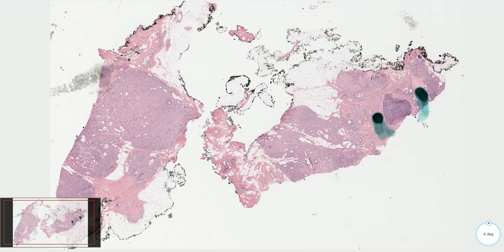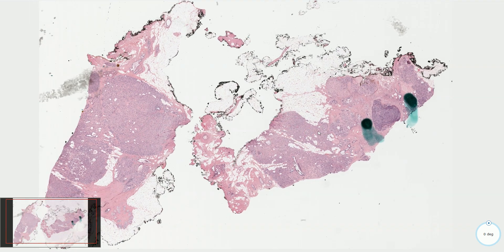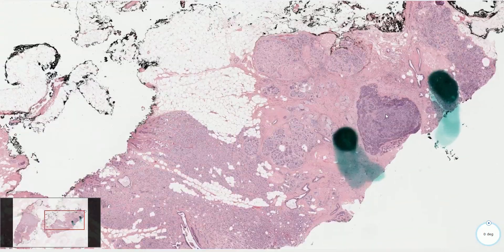Adenomyoepithelioma is typically a benign tumor with relatively low risk of recurrence after surgical excision. However, very rarely it might be associated with malignant transformation. This is another case where the benign component is well circumscribed with a thin fibrous capsule, but here we have a small nodule which is much more hyperchromatic compared to the rest of the lesion.